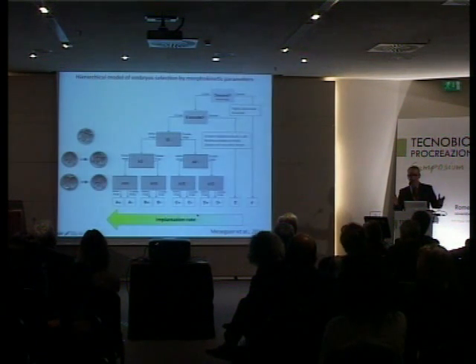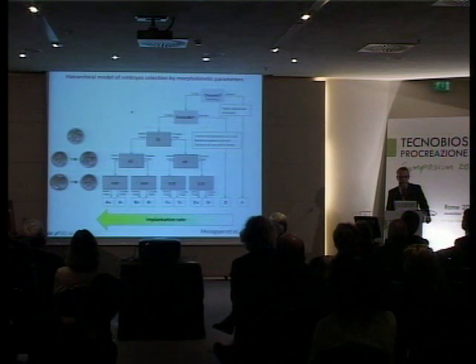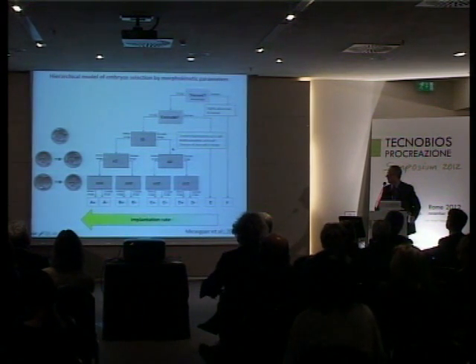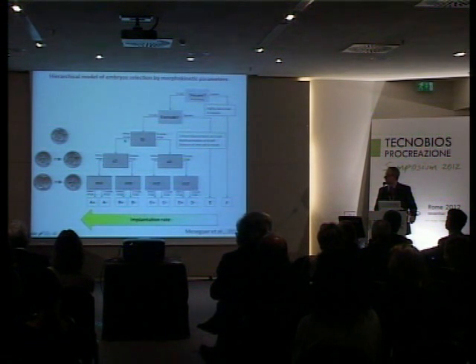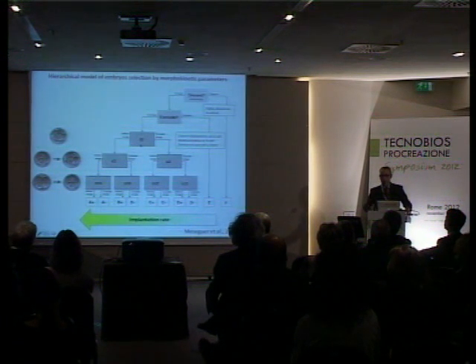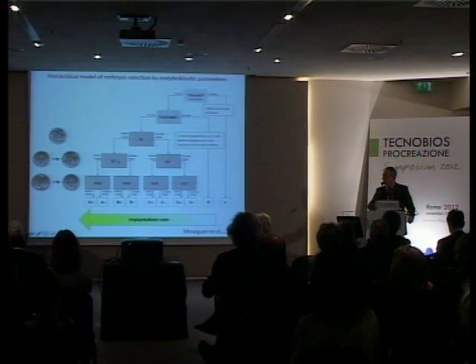So putting together these individual parameters in a pyramidal, or if you wish, a hierarchical fashion, they've been able to develop an algorithm that, in their hands, is able to predict the implantation rate of an embryo, depending on whether it is able or not to reach the 5-cell stage within a given range, and assigning to this embryo a score, and doing the same thing for the other parameters.